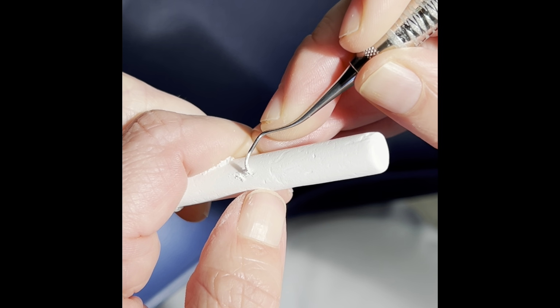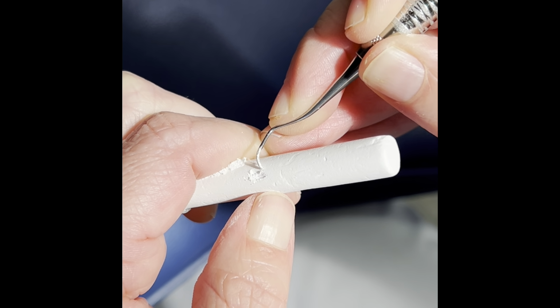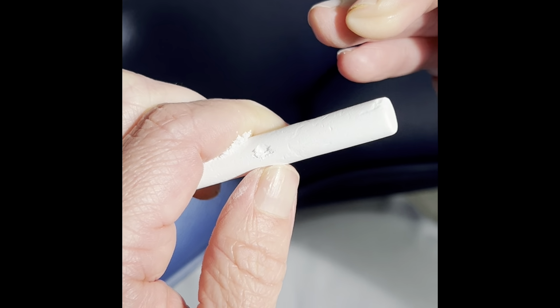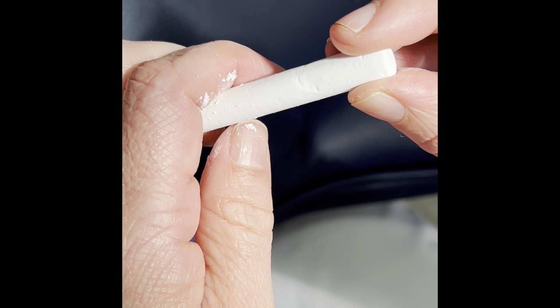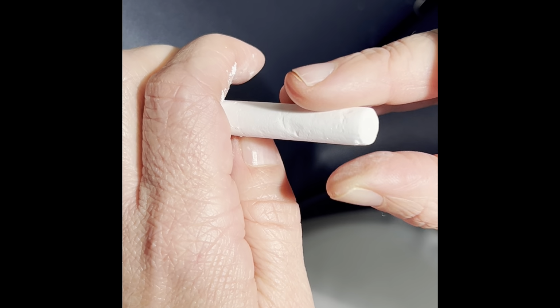You want to increase the pressure in your grasp, short, so only 1 millimeter or 2 with your stroke, biting stroke, and at the end, your chalk will have probably a little divot. Then the next one is the root debridement stroke. We're going to demonstrate that with the Barnhart 5-6 also.